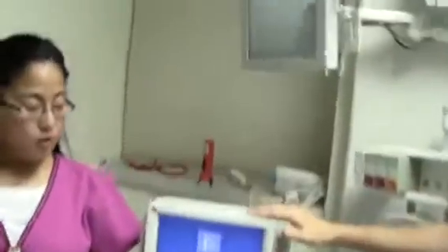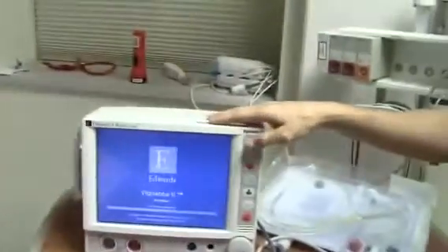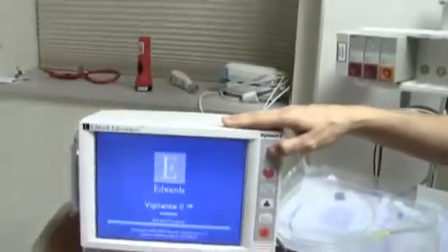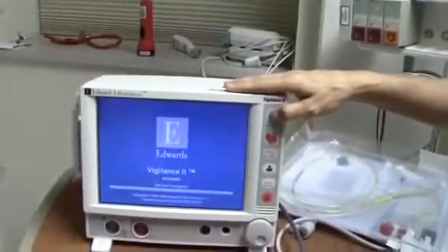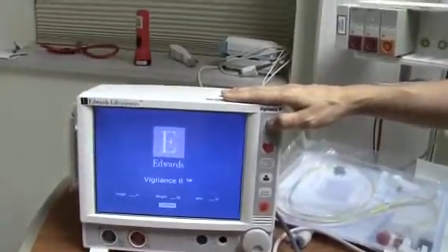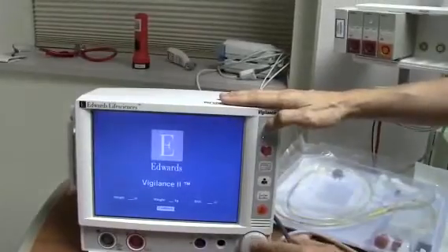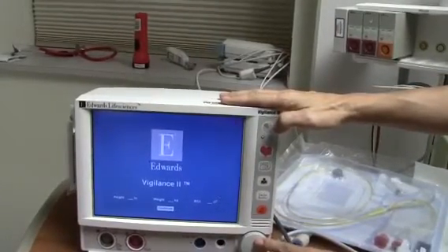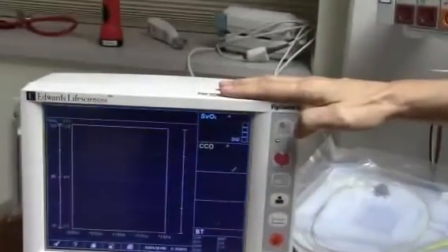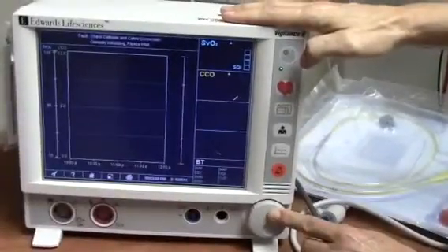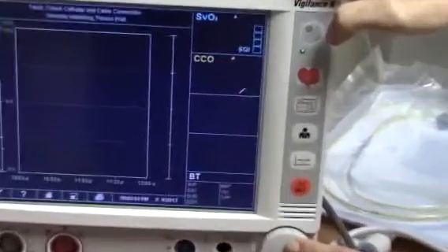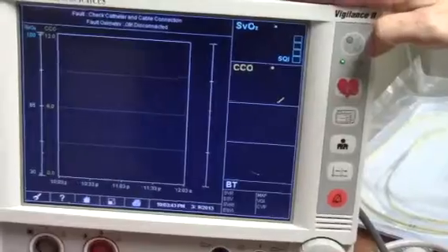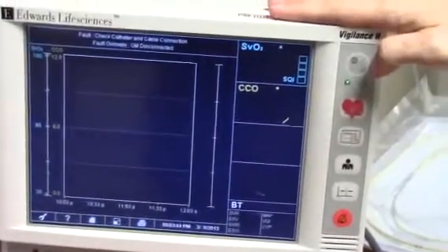Turn on the monitor by pushing the front panel button on the top right. The monitor will go into self-test mode. Pushing continue will bring you to the home screen. This home screen is now displayed.